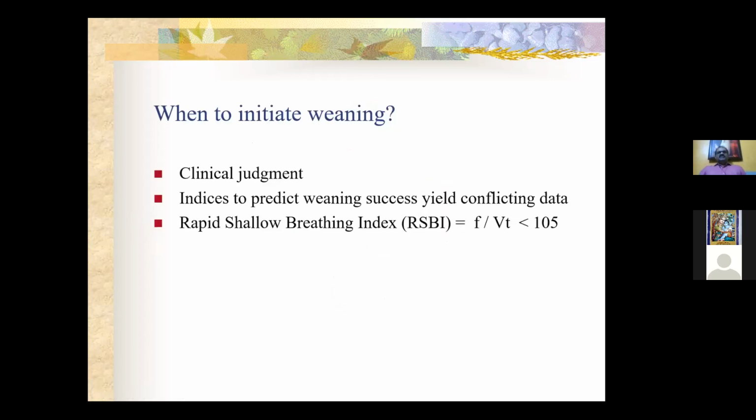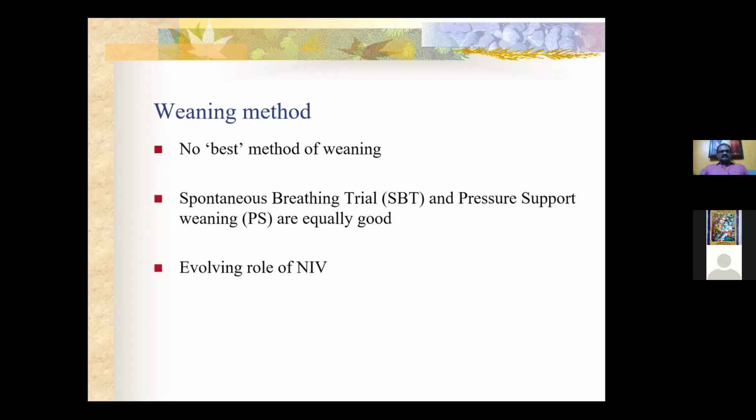When to initiate weaning is basically clinical judgment, and there are a lot of indices to say if the patient is ready for weaning. But if you just look into those parameters only, like rapid shallow breathing index and all this stuff, it might not be successful many of the times. So clinical judgment plus the combination of all these factors should be there to have a proper weaning.